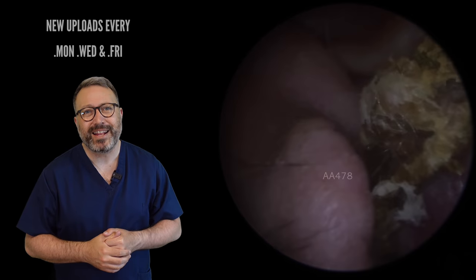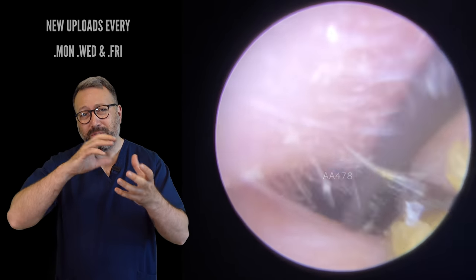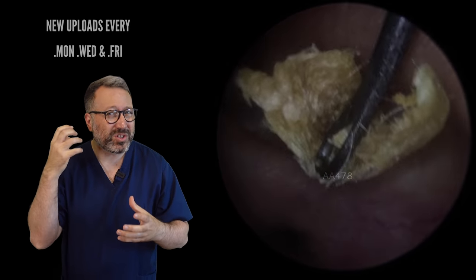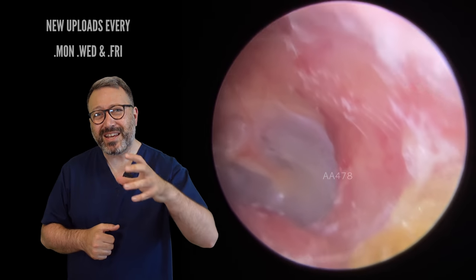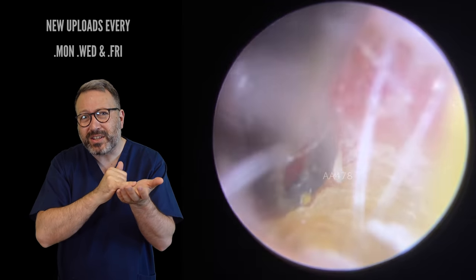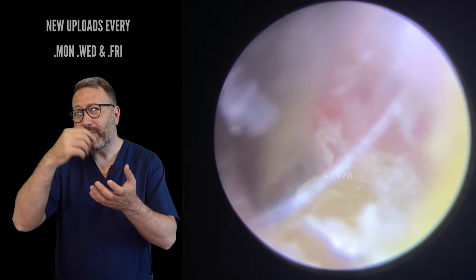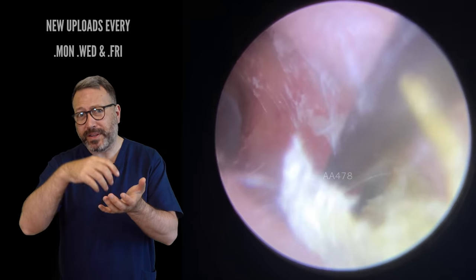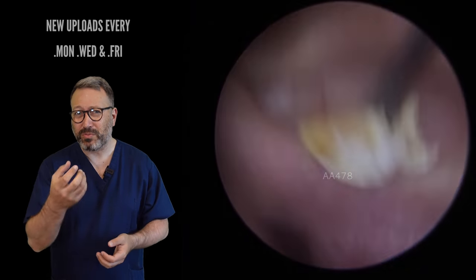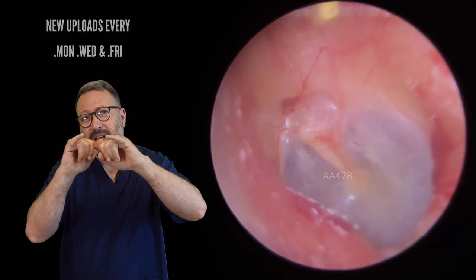Look at that piece of wax — it is huge. Imagine when you lay on that ear, and there's still more behind it as well. The cartilaginous portion of the ear canal will fold and flatten slightly when you lie on it, and pressing against wax that hard must have been so uncomfortable. It's quite red, quite aggravated — you can see where the skin has actually pulled away and where it's just sort of grazed the surface. This really, really tough piece of skin at the base of the canal — normally I wouldn't be as rough as this on the base of the canal, but this wasn't going to come away. Any skin there is just going to build up behind it, so I think this has been building for quite a long time. That wax had gone almost like leather — it was so, so tough, almost like a plastic consistency. You can see on the anterior recess where the skin was attached.